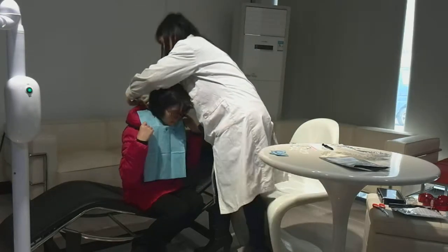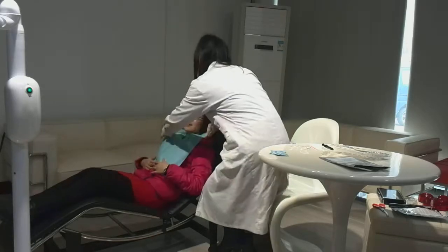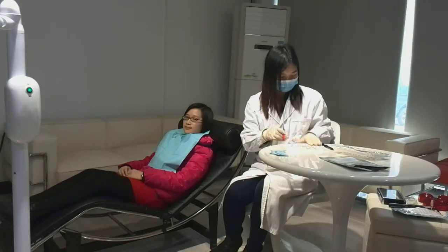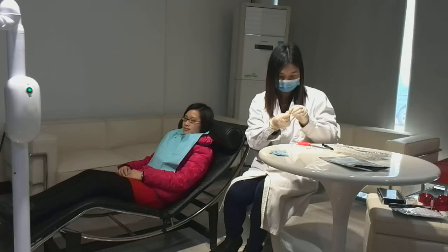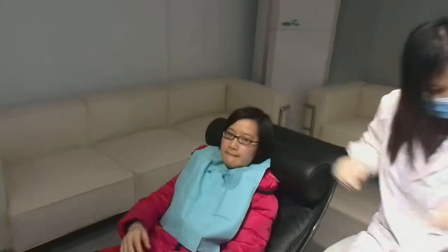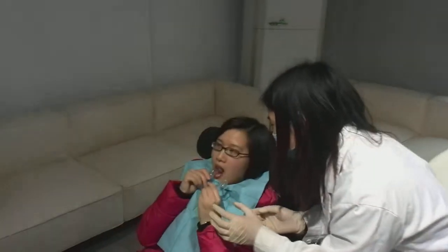Prepare first: put the dental bib on the patient. Then let the patient lie on the dental unit. Second, moisten the patient's lip with a VE swab to prevent drying. Let the patient put the cheek retractor into the mouth, and wear the goggles to protect the eyes.